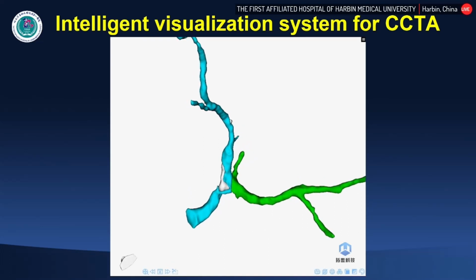We can see that in this patient there's a big calcified plaque from the left main to the proximal LAD, but it's not a 360-degree calcification. So maybe we can use a cutting balloon or scoring balloon to get a good result. Thank you.